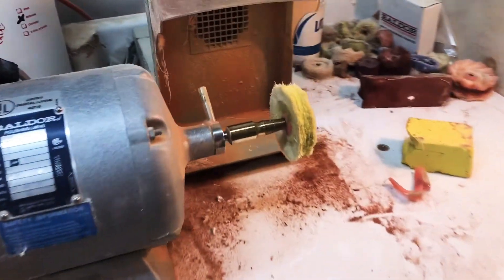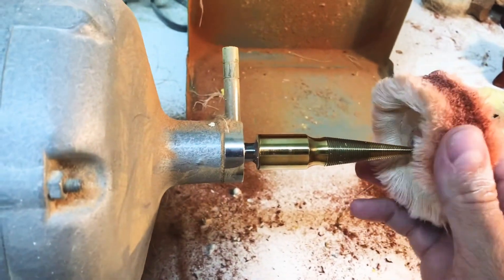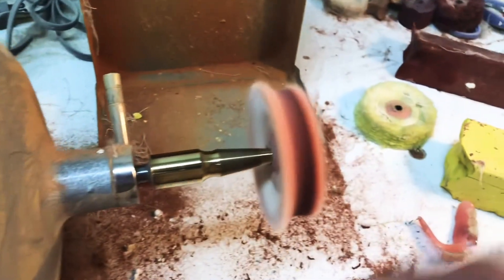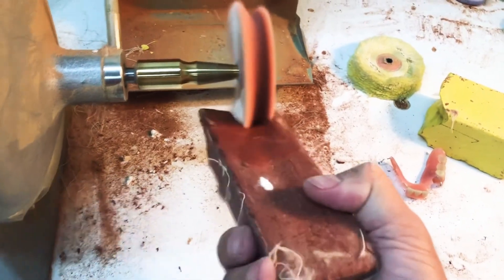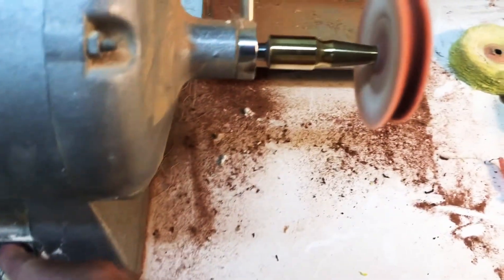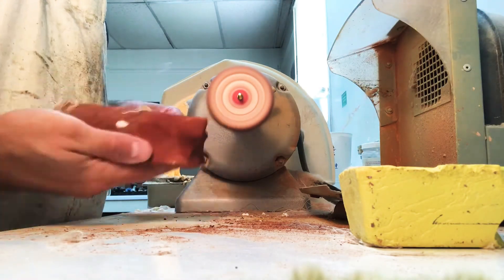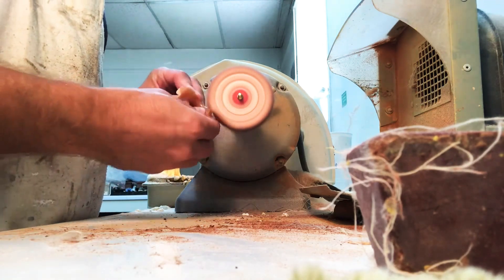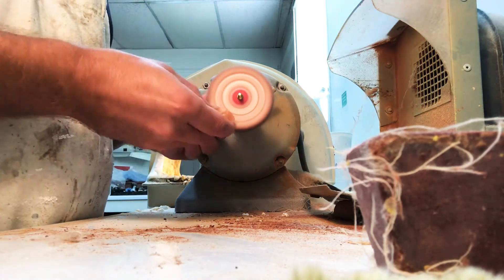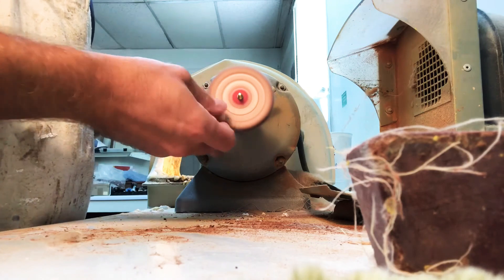Now we're going to move over to the other side of the motor, which will help us to finish down and shine up the partial. We're going to start with this Tripoli — it helps us to do some of the fine work and it will also give the partial a sheen. Then we'll move on to the high shine. You want to put your Tripoli on your wheel and then just follow it the same as with the pumice. Just be careful not to burn it or file down the teeth.